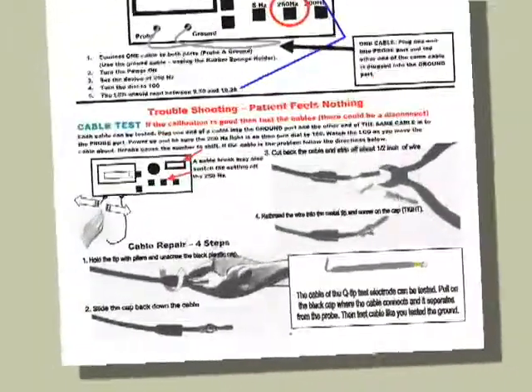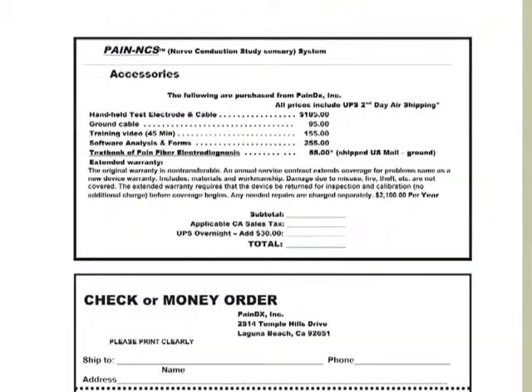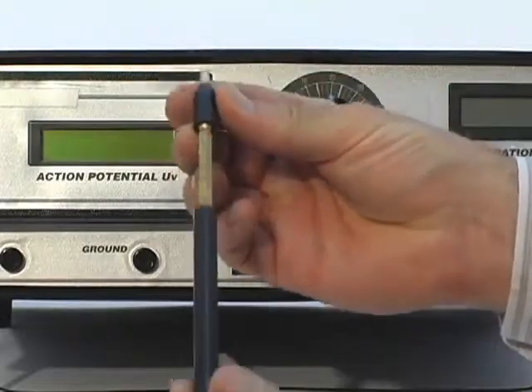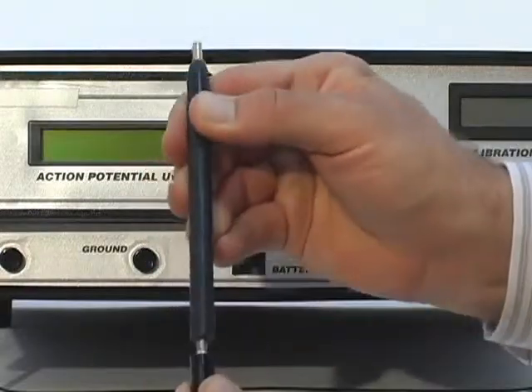Refer to page 3 of the online manual for how to repair a cable. Or to replace a cable or order other accessories, see page 24 for an order form and instructions. Reassemble the probe by putting the square tubing through the black sleeve and connecting the plug back into the end.